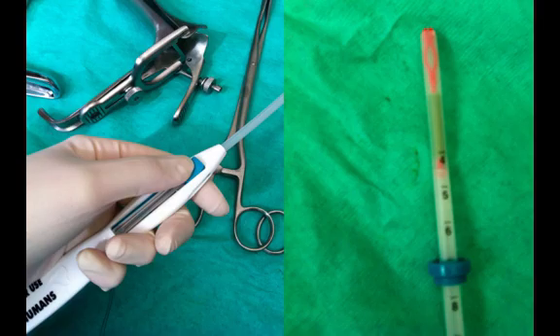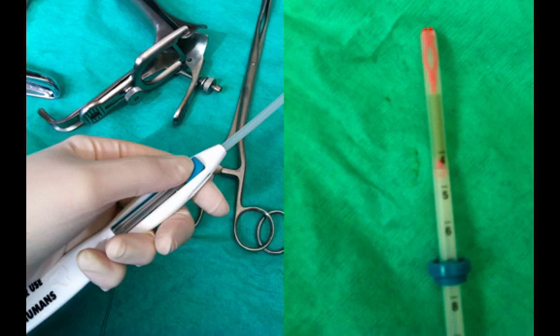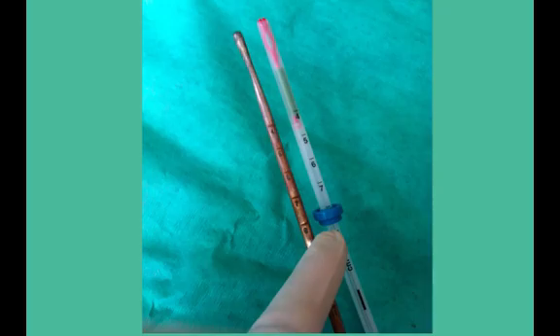Sound the uterine cavity and check the measurement. Open the sterile Mirena package, release the threads, push the slider to the furthest position, pull the threads so that Mirena is within the inserter tube and lock the threads in the cleft. Then set the flange according to the sound measurement.